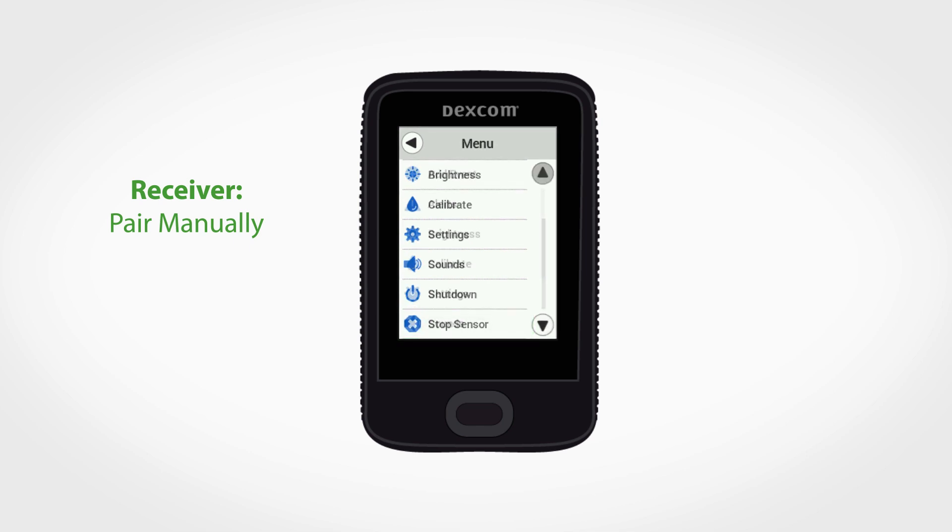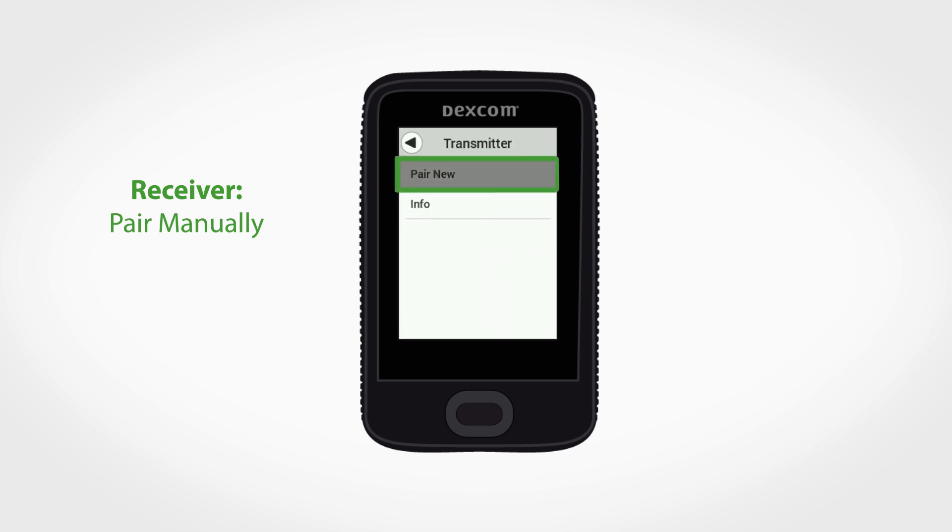To manually pair a new transmitter on your receiver, first select stop sensor within the main menu, then navigate back to the main menu and select transmitter, then tap pair new.